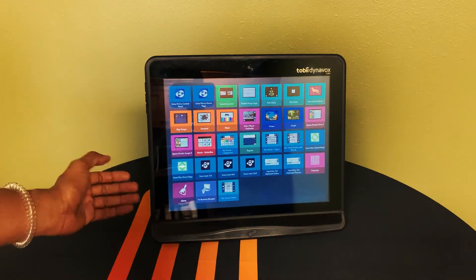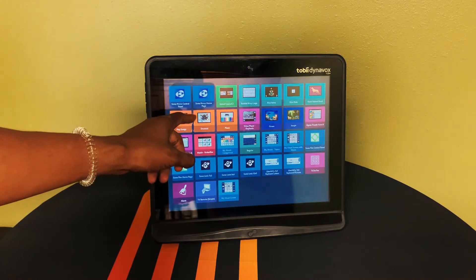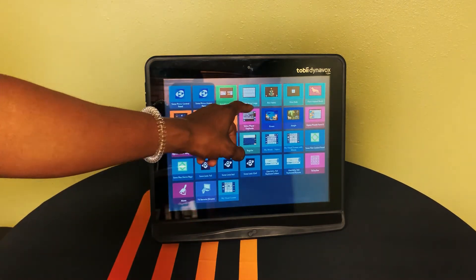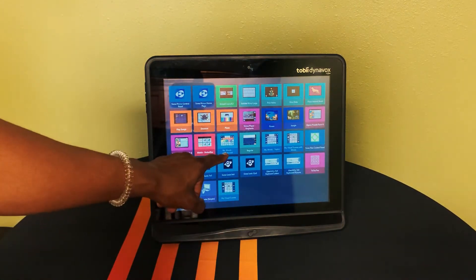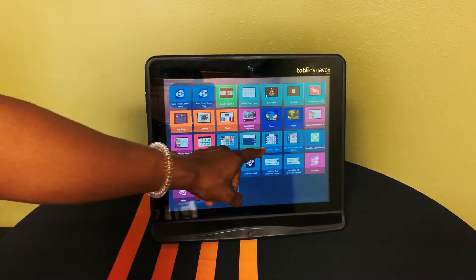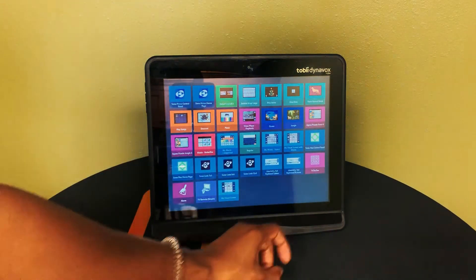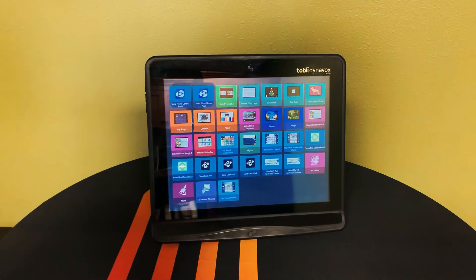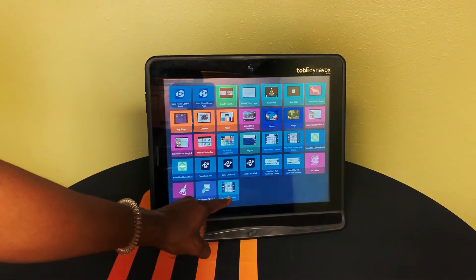Every i-Series device comes equipped with computer control, Snapcore First, and the Communicator 5 software, which will enable access to popular tools such as Facebook, Netflix, and other apps independently via the Communicator 5 accessible apps.